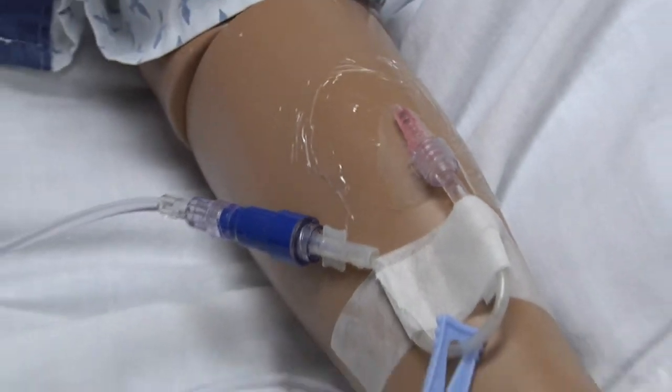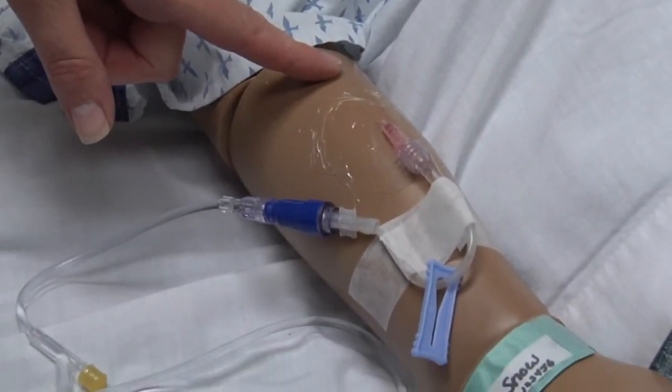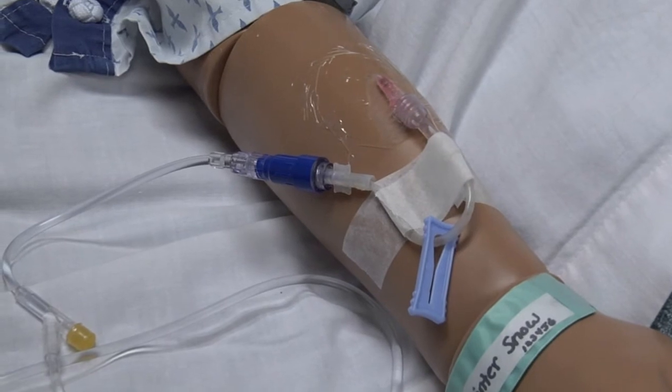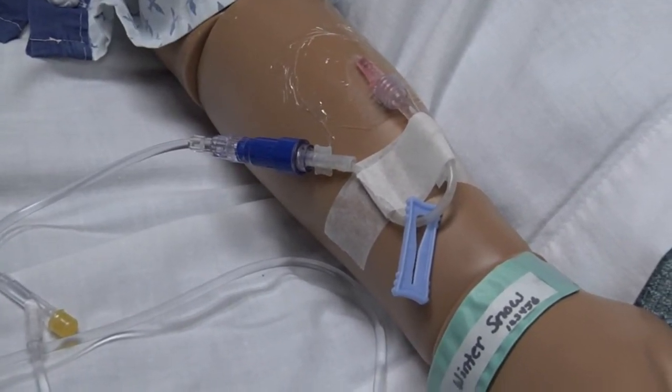It's running very slowly. And in that case, again, I would remove the IV from this site and restart it somewhere else. In either of those cases, I could put a warm washcloth onto her arm and elevate it to take some of that swelling or inflammation down.